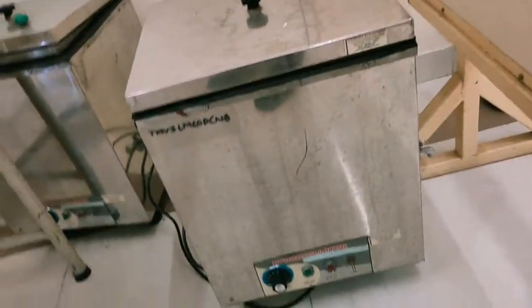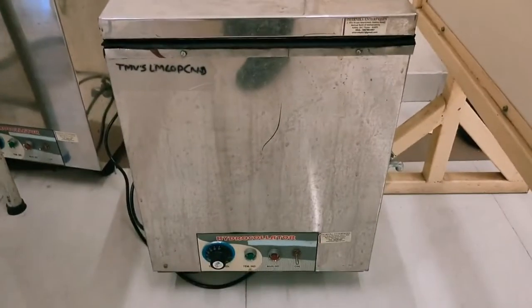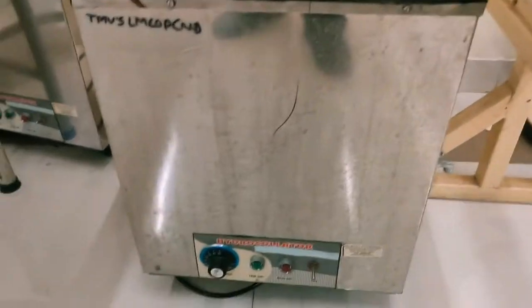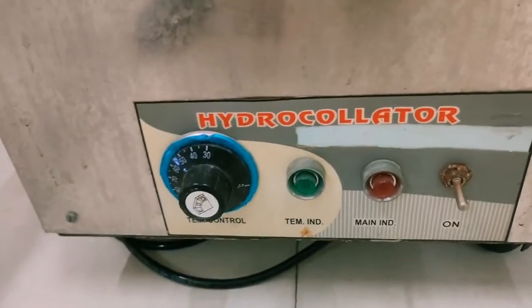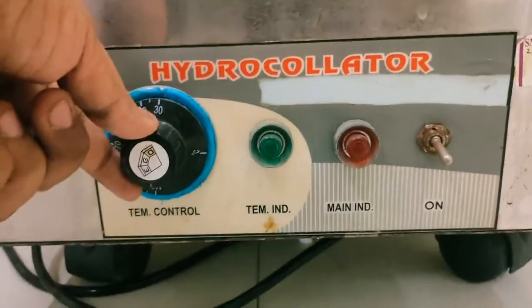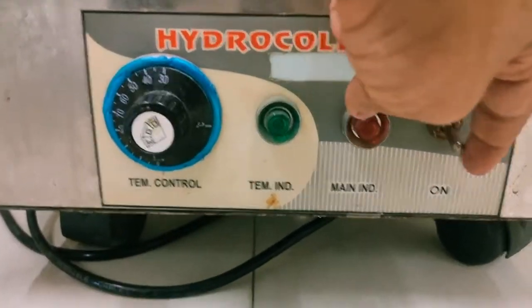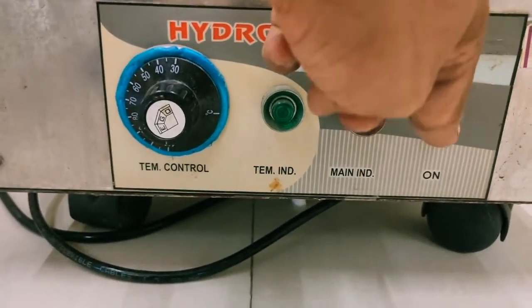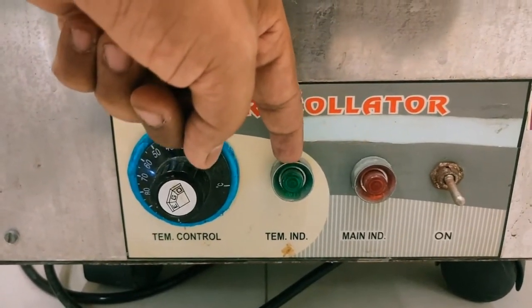Hello students, this is the hydrocollator unit. Here you can see there are some knobs and lamps available. This is the temperature control knob, this is the switch to turn the machine on and off, and this is the temperature indicator light.